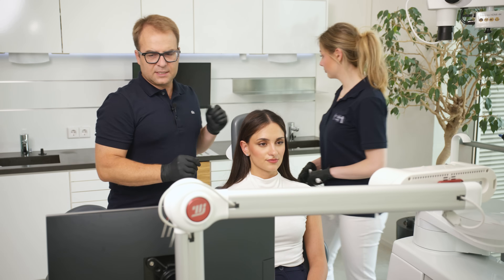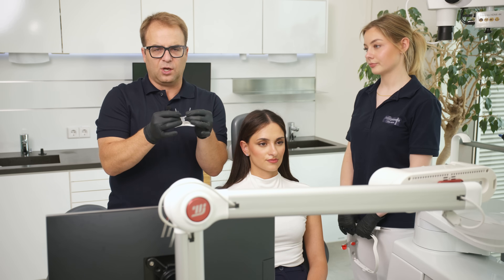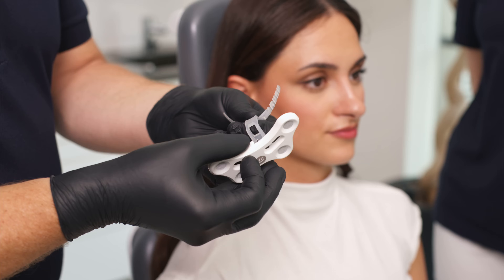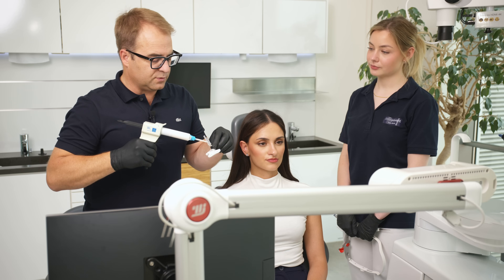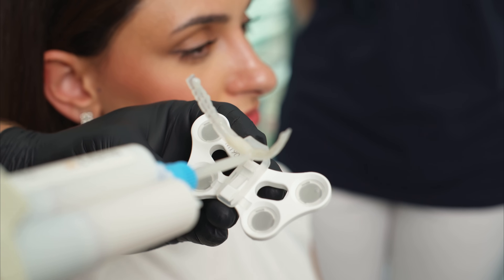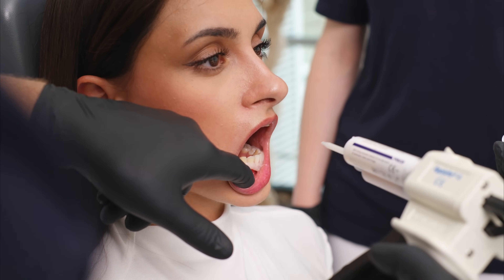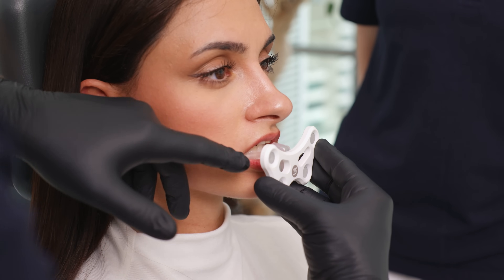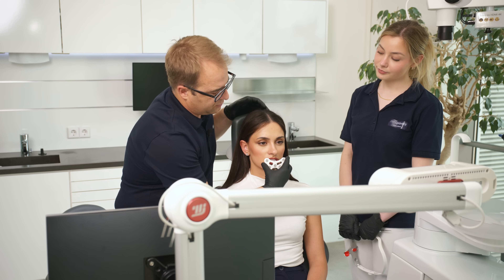The next step is the Smiley attached to the bite fork. The bite fork is made out of a soft plastic material, and the Smiley also has reflectors attached to it. I use a fast curing composite to attach the bite fork to the lower jaw — I put some of the material on the fork and on the outside of the lower jaw, then place the fork on the jaw and hold it for a moment. It cures quite fast, becoming stable in about 10 to 15 seconds.